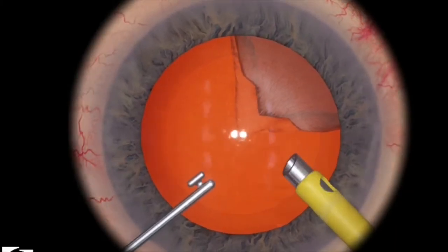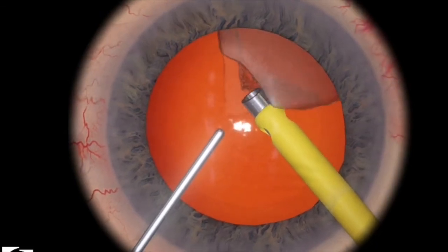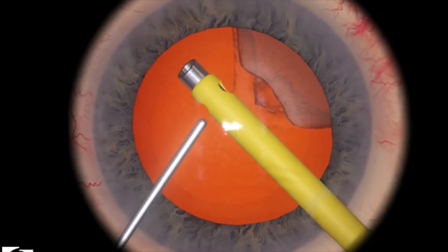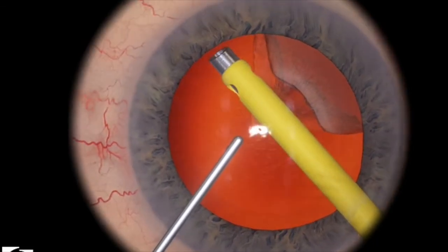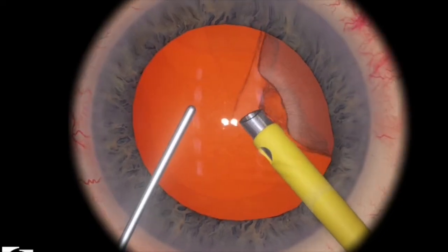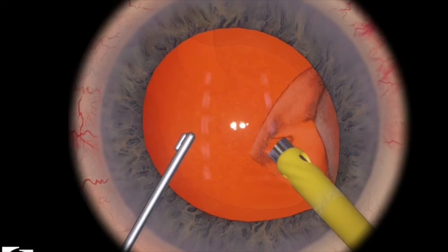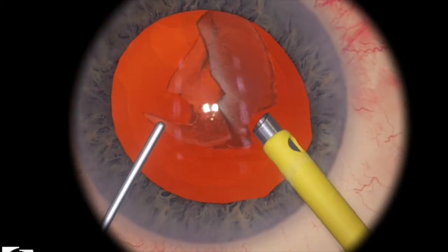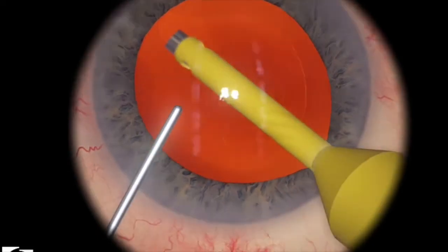Here are some examples of what you shouldn't do. Here I'm engaging the piece, but I've accidentally engaged the anterior capsule. And then you can also easily create an anterior capsule rip because of the ultrasonic energy, and this is the remaining piece. So try to engage with aspiration into the center of the eye, or the zone of safety. And then try not to engage the posterior capsule or the anterior capsule.